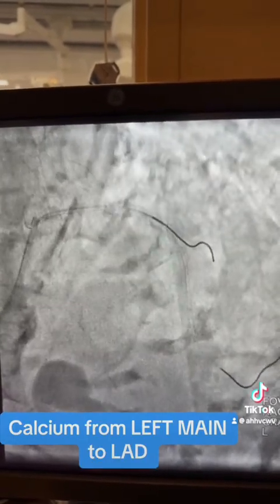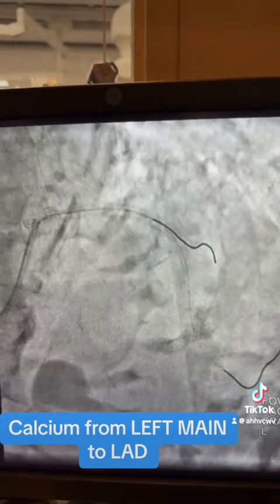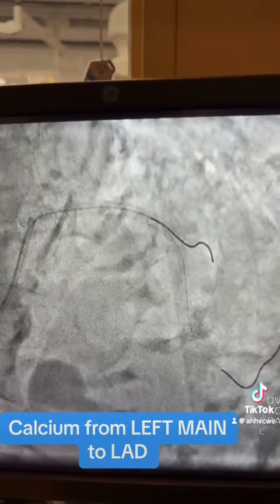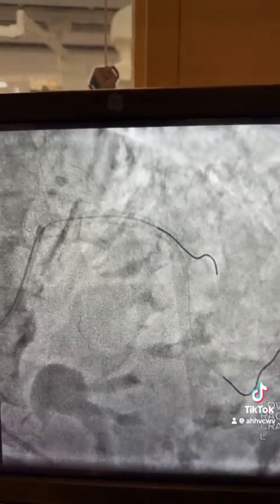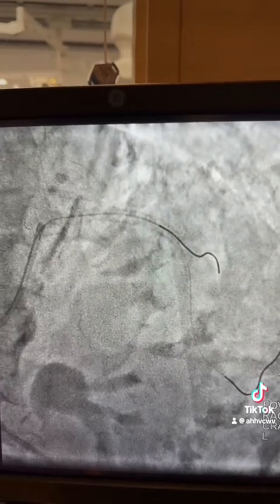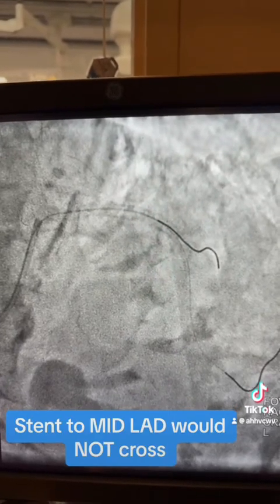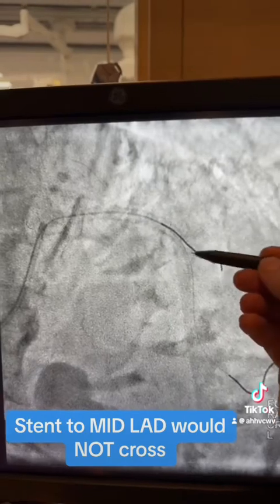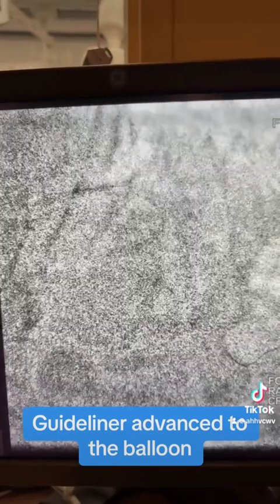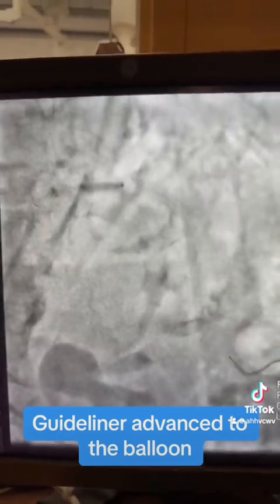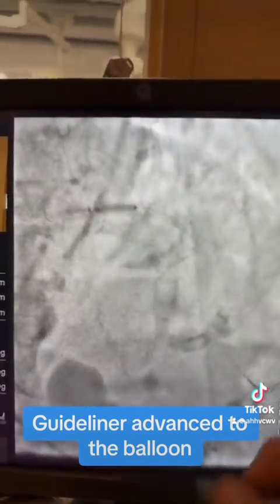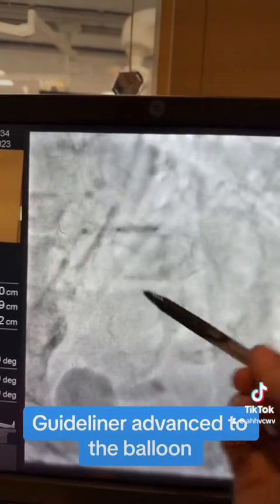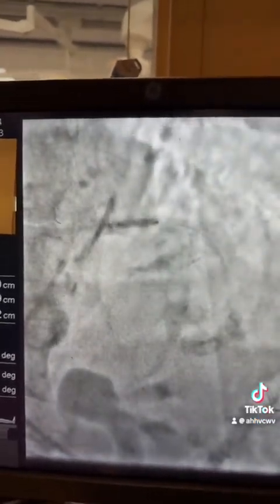Starting from the left main toward the LAD, you can see a big chunk of calcium, so the stent did not go through right away to the distal segment. I have to pull the wire and use the Guideliner. Here the balloon is advanced, the balloon is inflated.